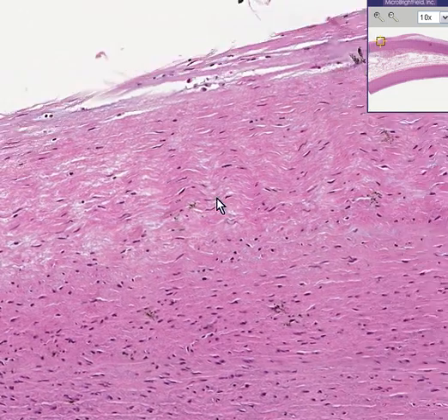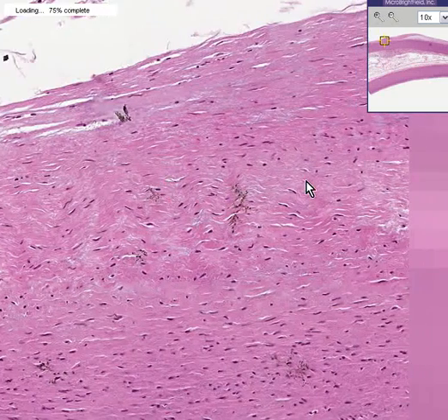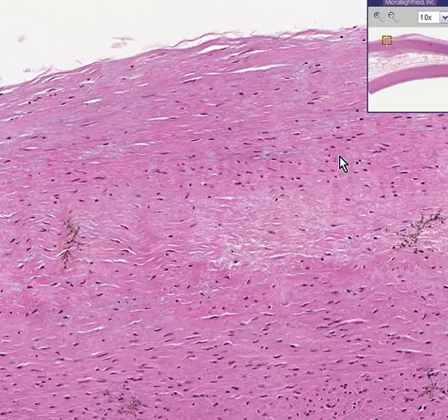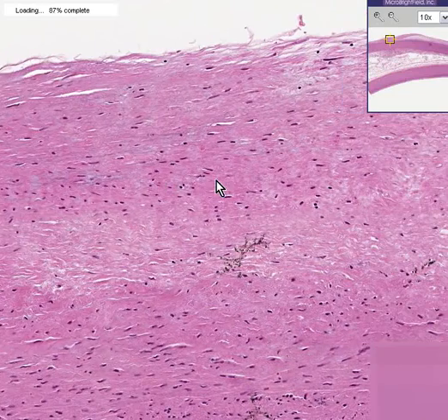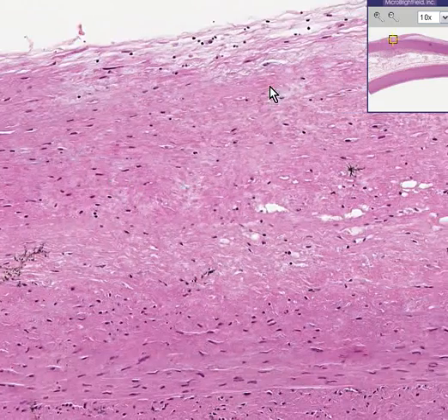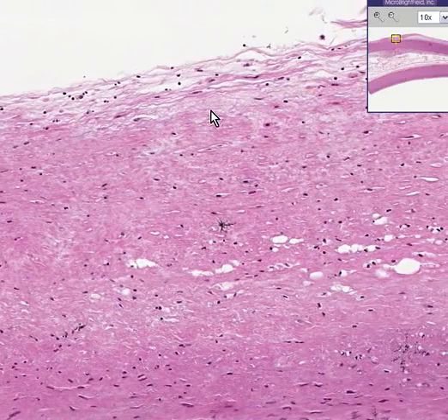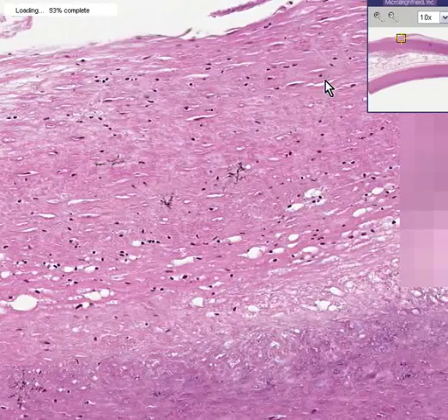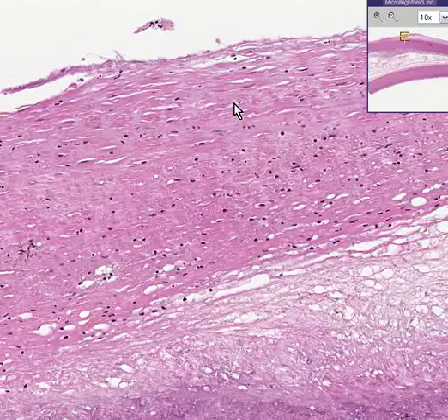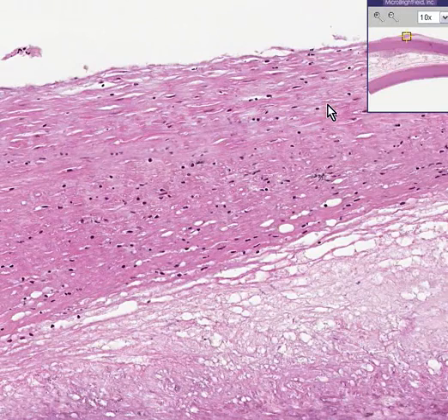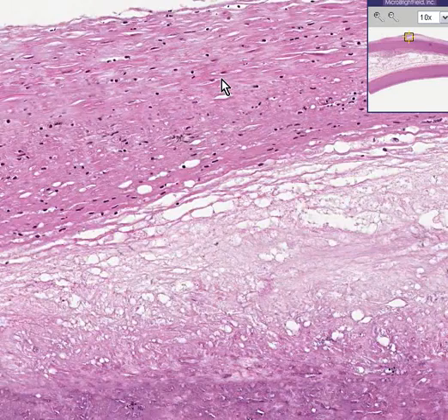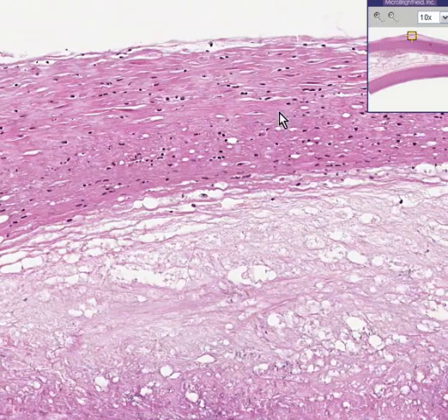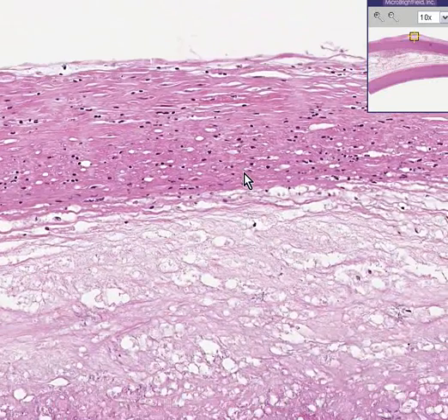Notice how as we get closer to this area, some of these elastic fibers and smooth muscle cells are getting a little whitish — they're being replaced by a kind of granular, whitish substance. This is precisely what we saw as the fatty streak. If the fatty streak was large enough to be palpated, it could probably be called a plaque. So here is a plaque.